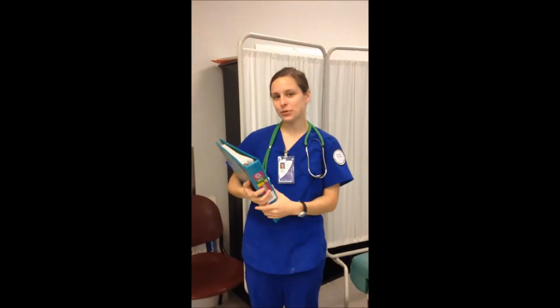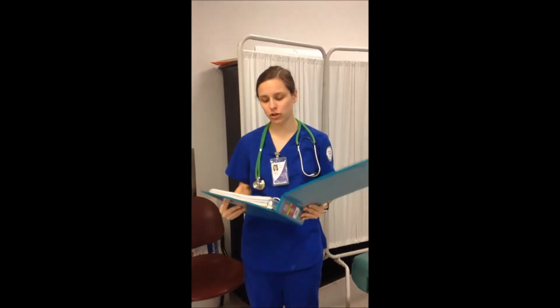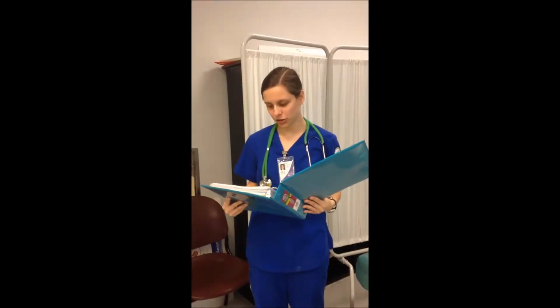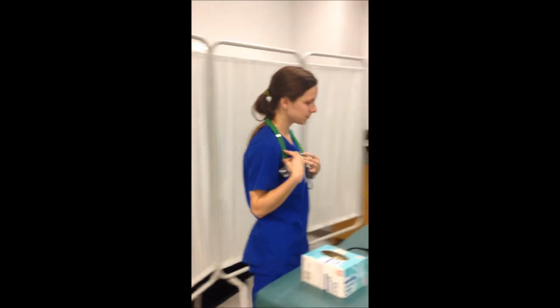Hi, I'm Cassidy. I'm the respiratory therapist. I have an order to intubate my patient. I'm going to check the chart for the order and any contraindications. There are no contraindications for this patient. I'm about to enter the patient's room, explain the procedure, identify my patient, and ask him a few questions.